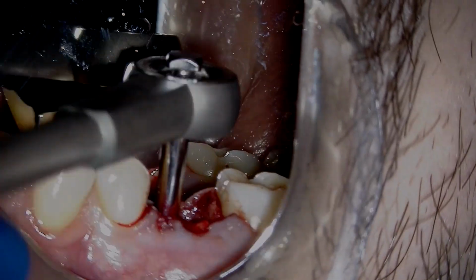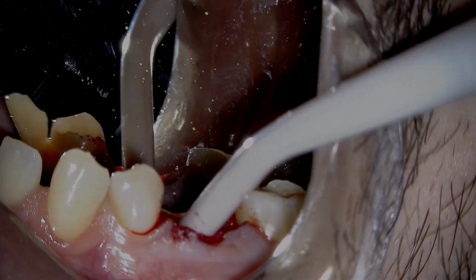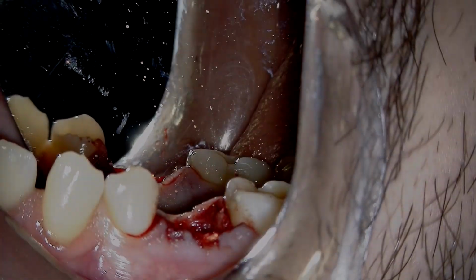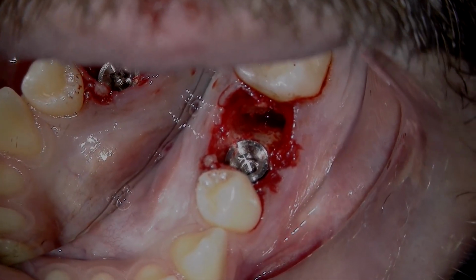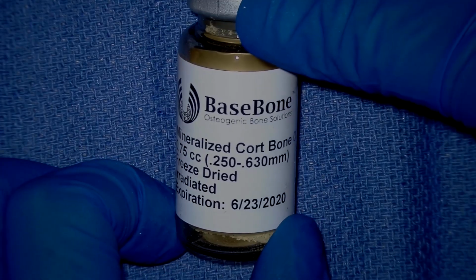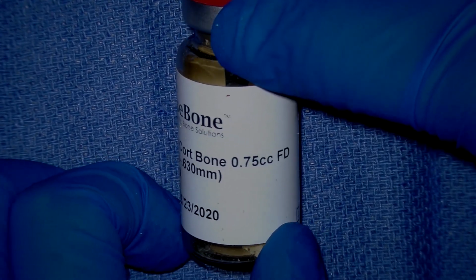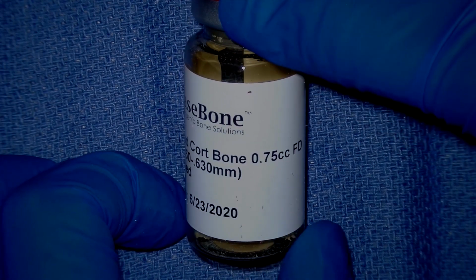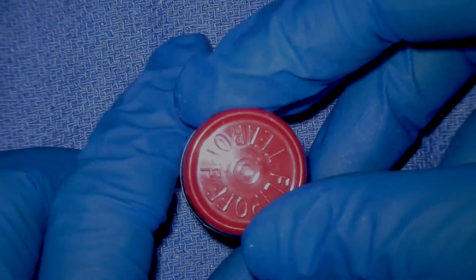Let's line that up, and I'm going to advance it a little further down. I'm not quite there yet. Okay, let's take a look at this. So there's my implant. I'm also showing you the extraction site of the distal root. I'm going to use some base bone, and this is mineralized cortical bone. It comes in a vial that's 0.75 cc's, and remove the top.